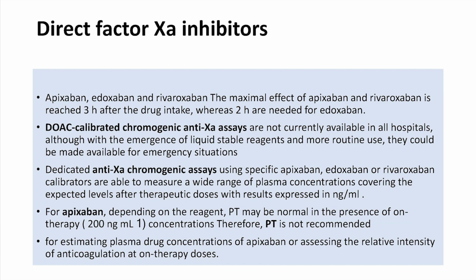For apixaban, depending on the reagent, PT may be normal in the presence of a therapeutic level, which is around 200 nanograms concentration. Therefore, PT is not recommended for estimating plasma drug concentration of apixaban, or assessing the relative intensity of anticoagulation on a therapeutic dose.